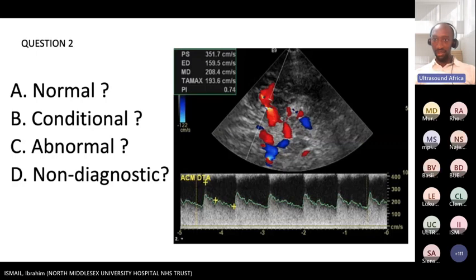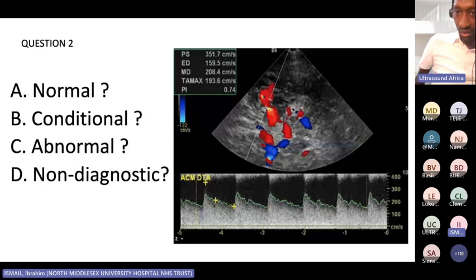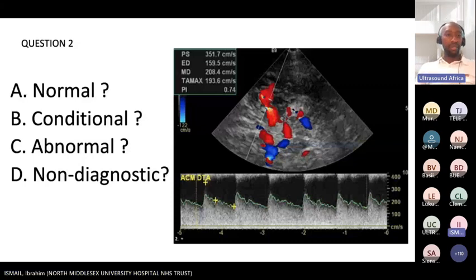There's a question from Adia Kajimu. She says, do you utilize the Lindegaard ratio to differentiate between vasospasm and hyperemia with TCD within the TCD study? Sorry, I didn't quite hear that. Say that again, please. Do you utilize the Lindegaard ratio to differentiate a vasospasm from a hyperemia?